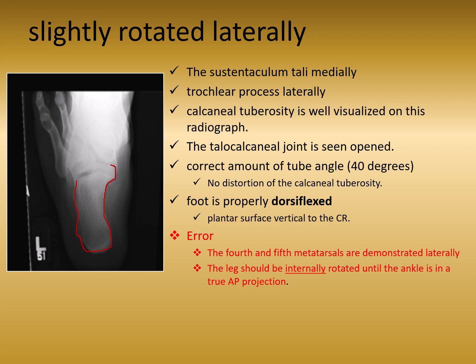But that rotation is kind of taking away from the diagnostic quality of those lateral and medial structures that we're looking for on that calcaneus. So, yes, the angulation was good, and yes, the joint is beautifully opened, but it is slightly rotated laterally. So we should internally rotate the leg and take another image if necessary.